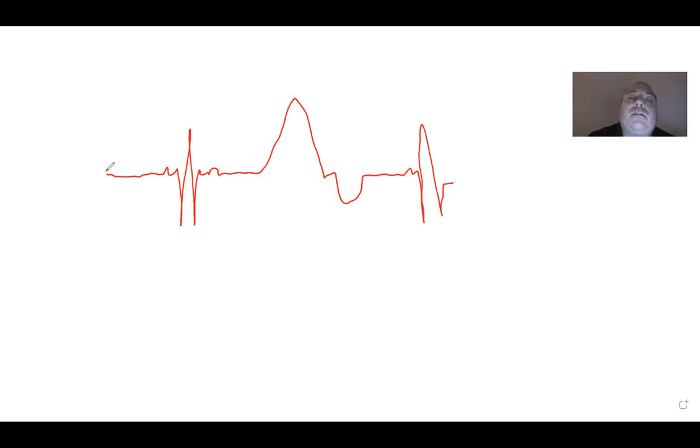Okay. So a premature ventricular contraction. Remember, we said when you have ventricles contracting, you have a wide QRS. So if you had a narrow QRS, and then a PVC, narrow QRS, PVC, so on and so forth, right? I mean, this is grossly exaggerated, but when we see it on some strips, it'll make sense. We're just explaining it for right now. So when you have a PVC, the hallmark of a PVC is a wide QRS, okay? So it's a wide QRS, and following the same theme, it happened before it should have.